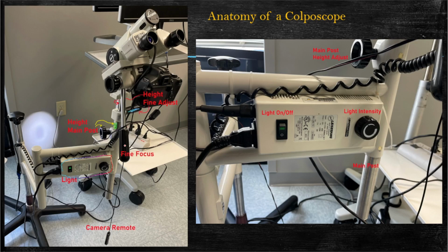And then it obviously rotates here with this handle, and twisting this handle is the fine focus. Just moving the scope forwards and backwards is kind of our gross focus control. So again, light on and off, intensity.